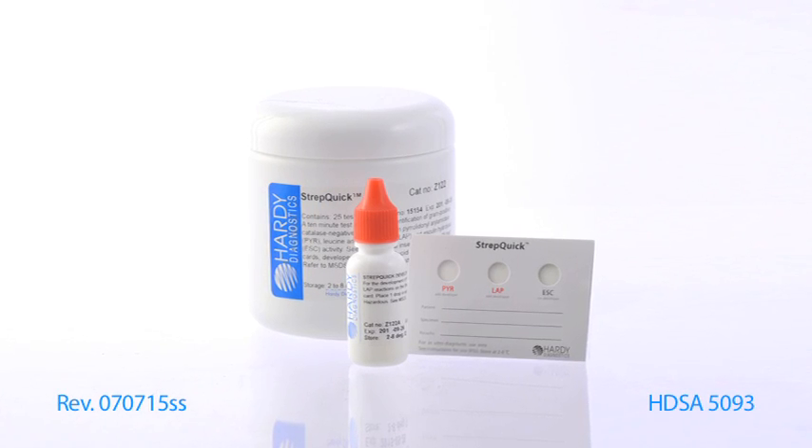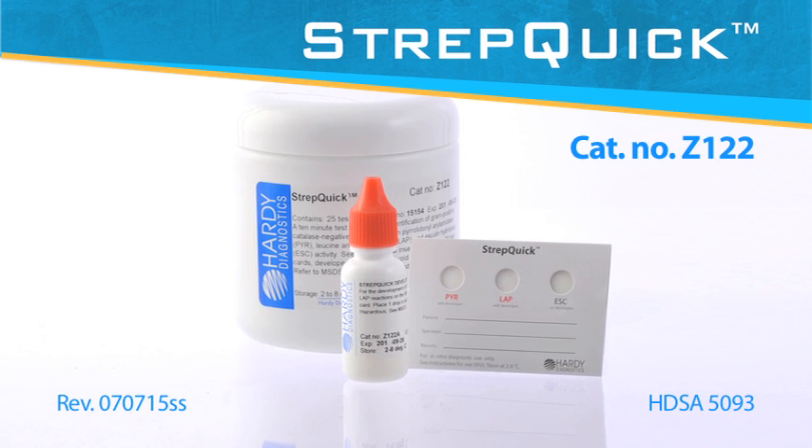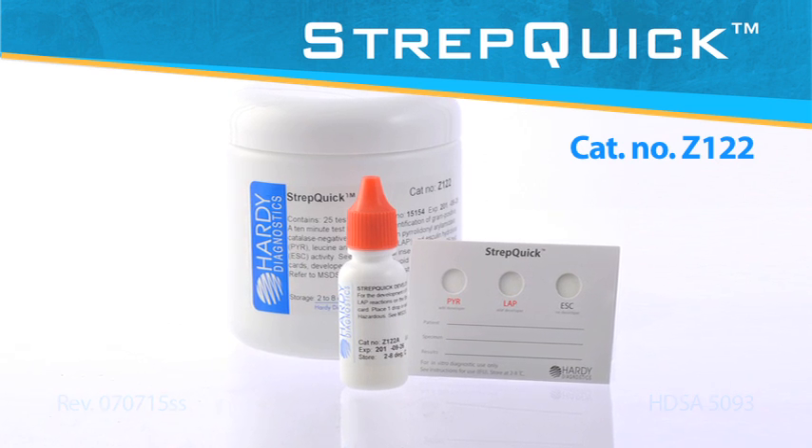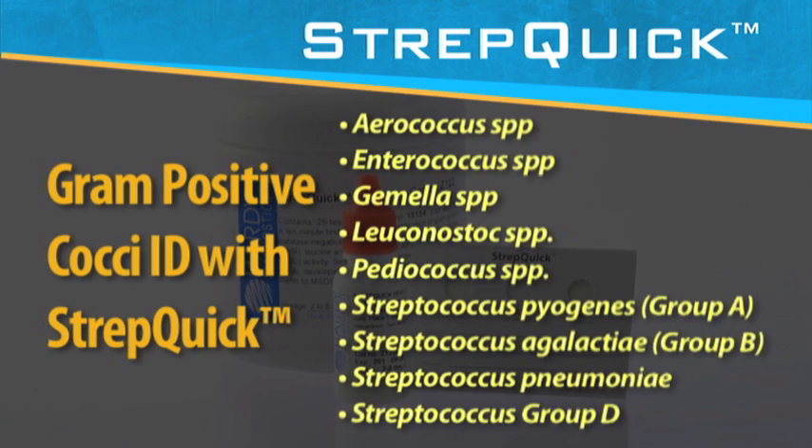This short demo will describe the Hardy StrepQuick system that will assist you in the identification of gram-positive cocci that are catalase negative. Here's a list of the organisms that StrepQuick can help you with.